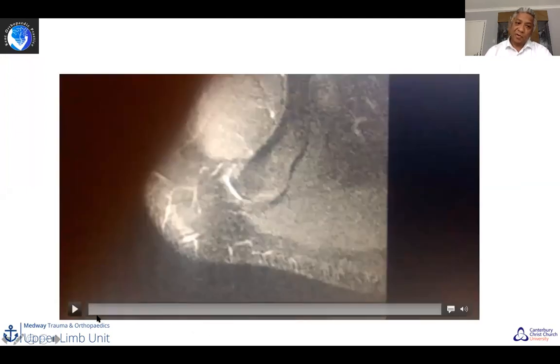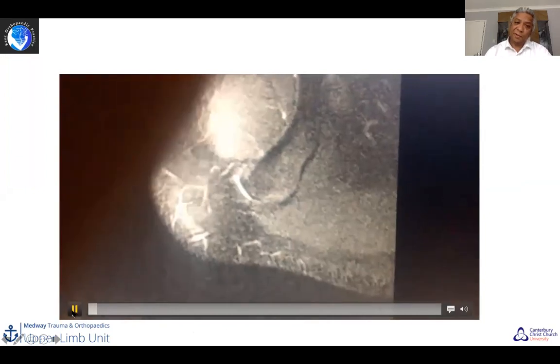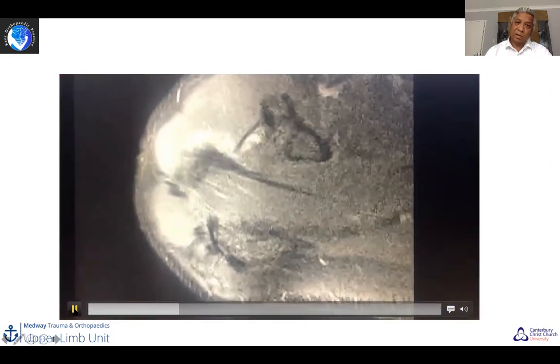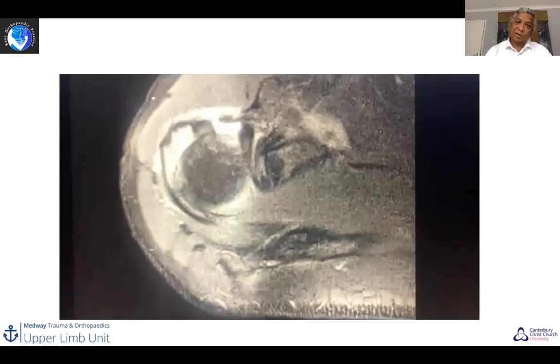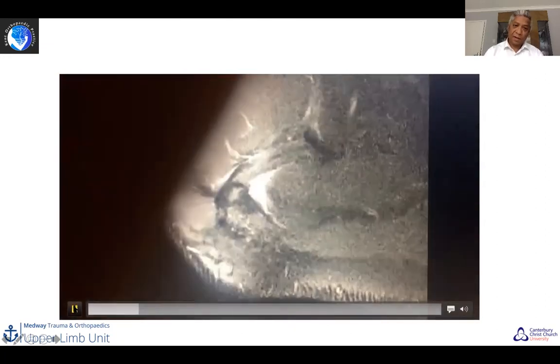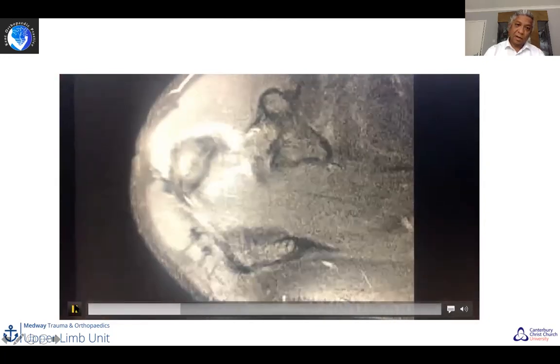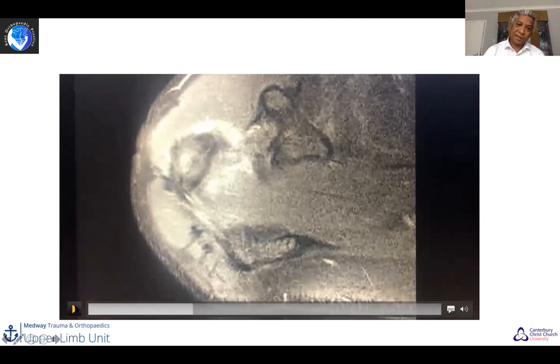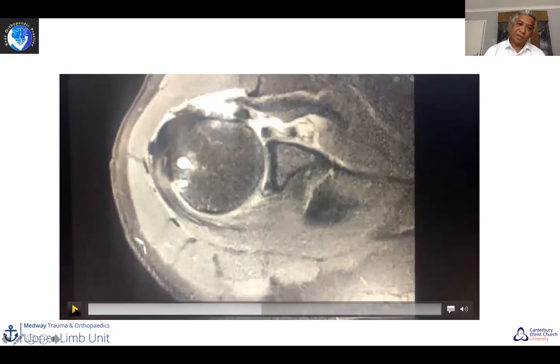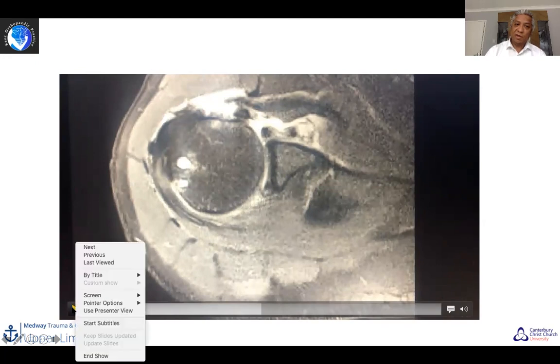So again, a short video of the scan from the top. Again, you can start to see the glenohumeral joint coming into the picture. You can sometimes see the supraspinatus tear. It's only in big tears coming at the level of the glenohumeral joint now. You can see that there is a lot of fluid here, abnormal signal in the front there and in there. So let's go forward.